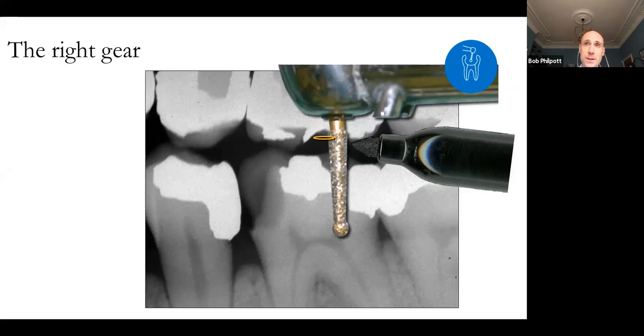And the reason I like that simplicity is that, number one, I know that the burr will be there, and it always is. Number two, my thought process is simple. I think, yeah, this is what I'm going to use. And I'm familiar with it. And number three, the monotony of the familiarity is what makes it easy for me, because I know the system and I've used it loads of times before.